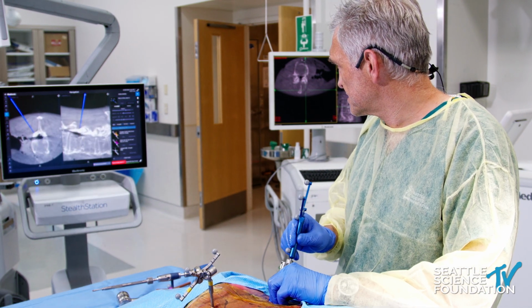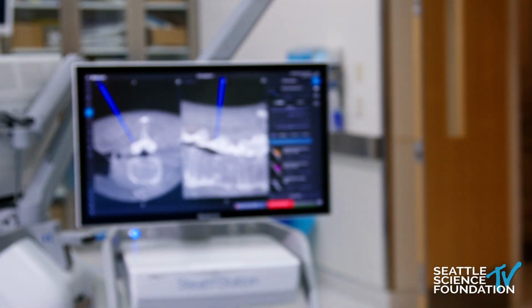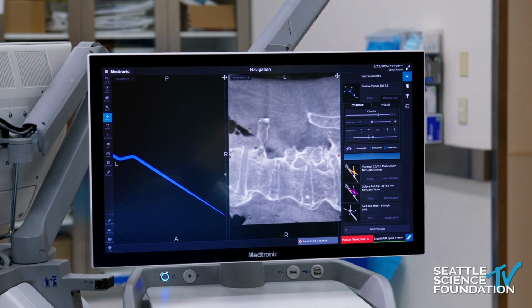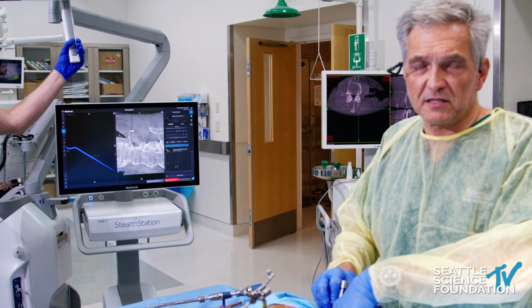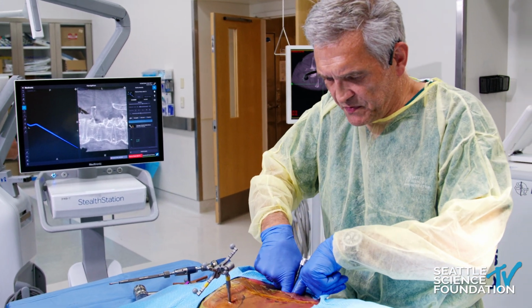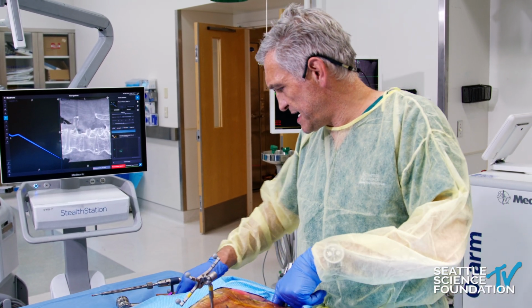See, that's the lamina, and then that's the step off here. This is all overgrown here, but this is where I would put the dilators in, and I would dilate and put the tubular retractor in. Because I dock more medial than probably most of you, it never really interferes with the pedicle screws. That's why I can put in the pedicle screws and just work around that. And then I bring in the microscope and do my facetectomy. That's really it.